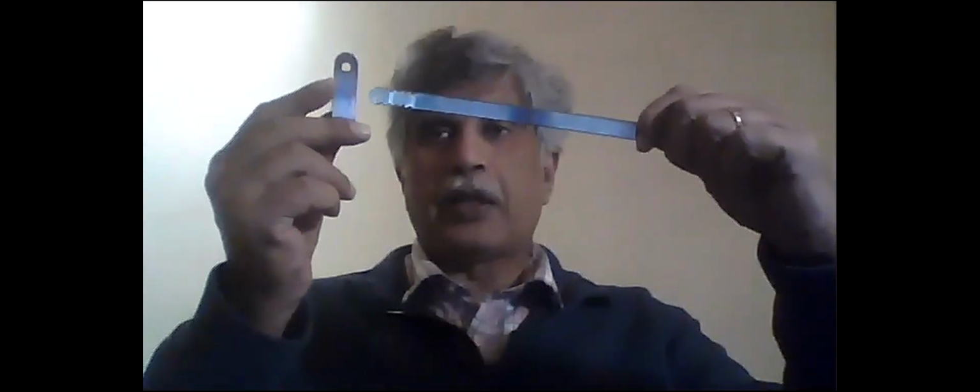So if you guys are watching, this is the bar. I bent it, it's taken out from someone, and these are the stabilizers. See, if you put a bar through it, the stabilizer stays, so it prevents it from rotating. The stabilizer will prevent it from flipping or going inside. They stay on the lid and they protect it.